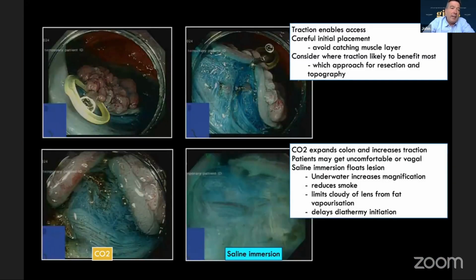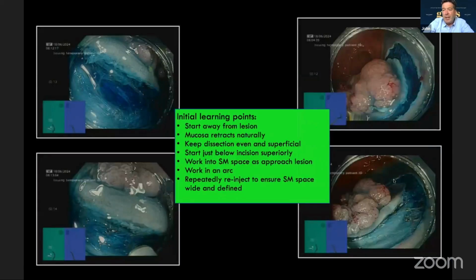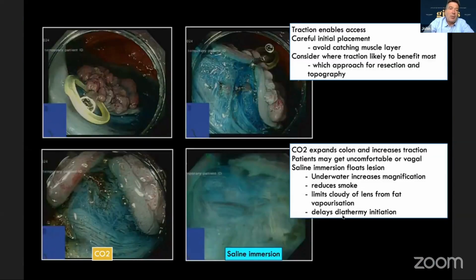So here, we're going to put some traction here, and you can see in the previous one, we've kind of gone as far as we could go. Yeah, we could dig the cap under here and we could keep trimming. It's so much easier just to put a clip on, put the clip on the opposite wall, and then you're fully exposed. You can see the muscle there beautifully. And if I was to attack this now, the black bits are where we've sealed vessels.